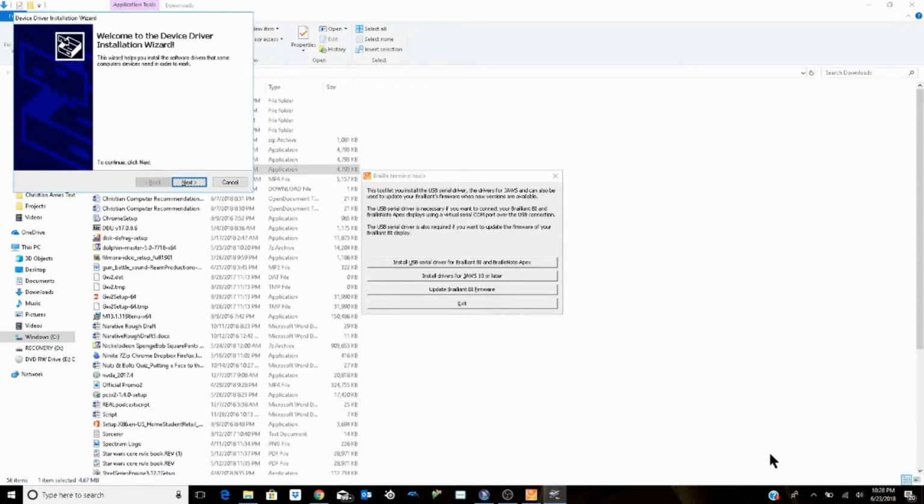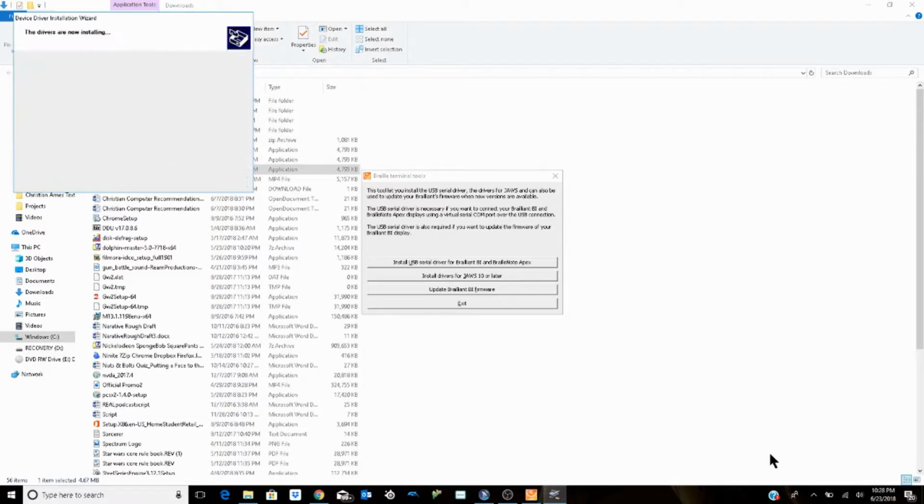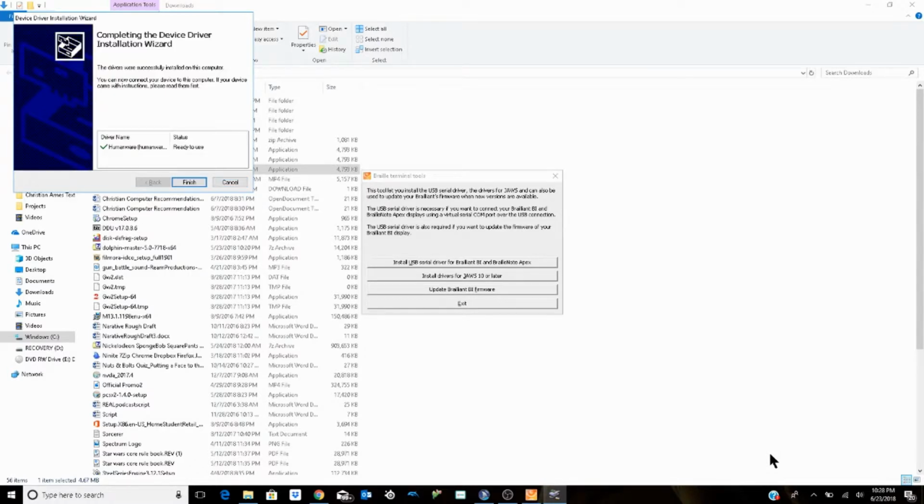Space. Yes button. To activate, press spacebar, Alt followed by Y. Space. Device driver. So what just happened is that it popped up with a screen saying, do you want to install this driver? And I just clicked yes. Tab. Cancel button. Shift tab. Next button. To activate, press space. Please wait while the drivers install. This may take some time to complete.